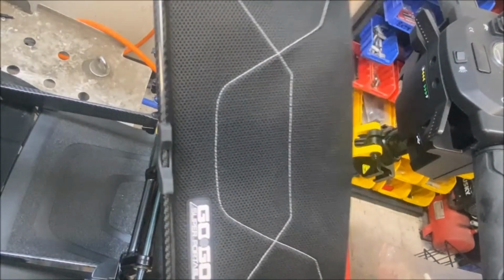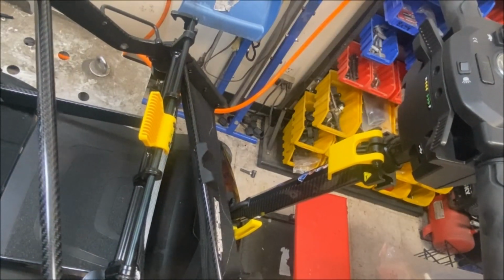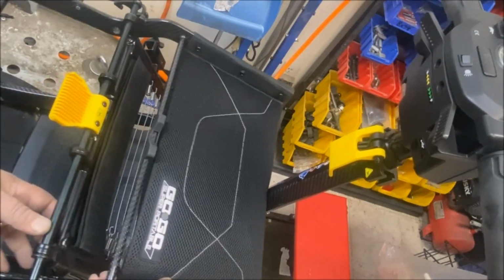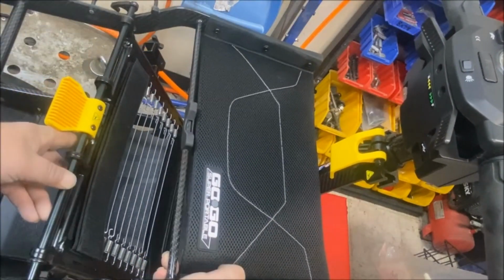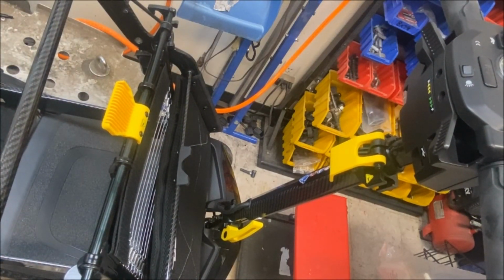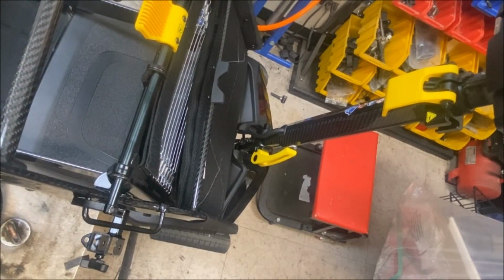Okay, so I'll put this side in first. Either side doesn't matter, as long as you don't scratch up your carbon fibre bit. And hook it over the locking mechanism. Alright. Now I can start reassembling it. I'm going to work on this side first because it's closer to me. Just make sure I get my inserts in.